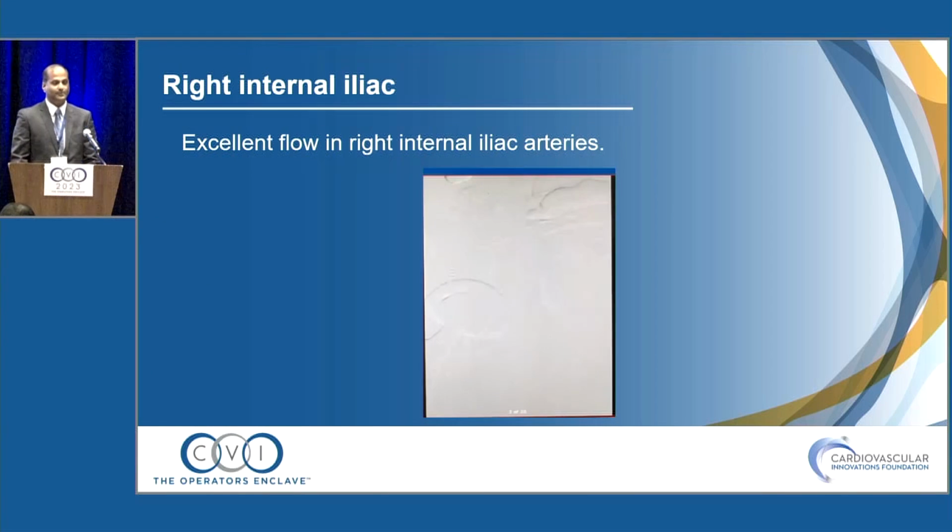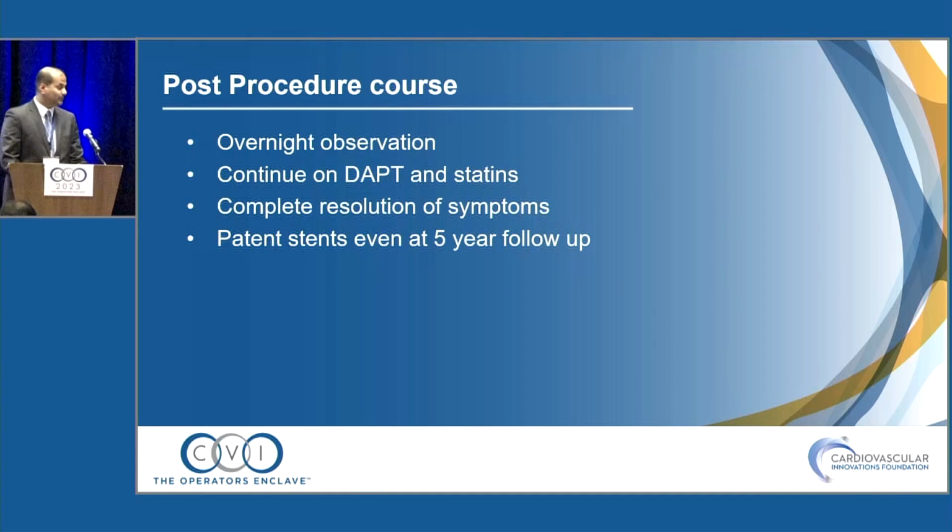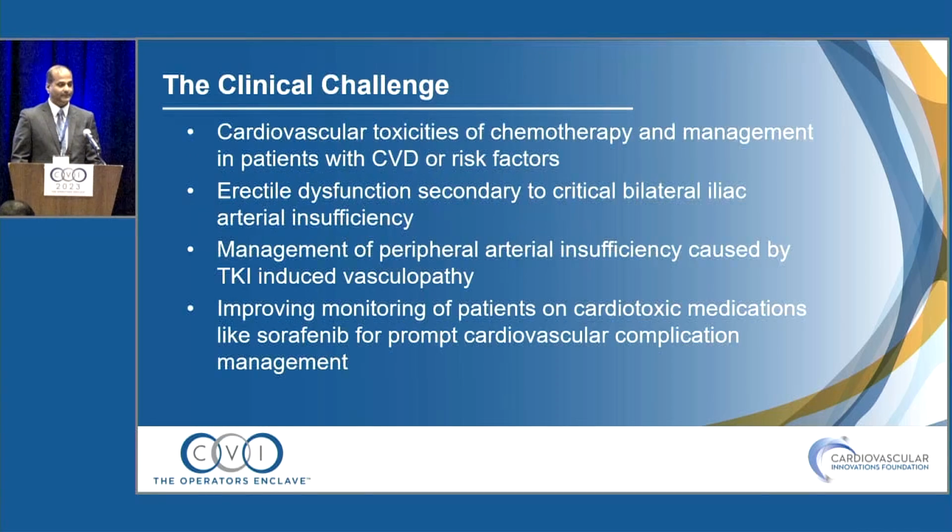Okay, and then we ended up getting some good flow in the internal iliac as well, right side. So post-procedure, the patient did well. He was continued on DAPT and statins with complete resolution of symptoms. Even at 5-year follow-up, he had patent stents.